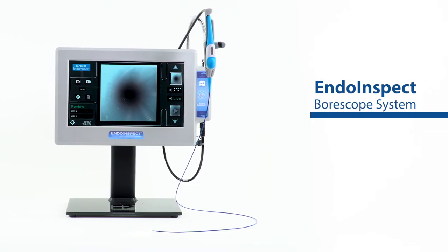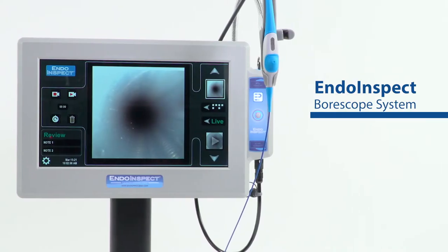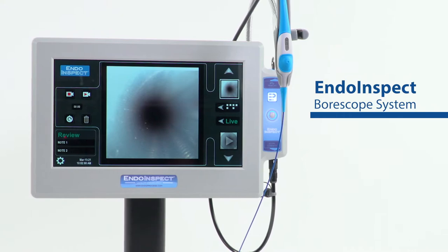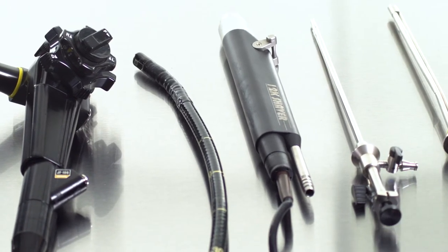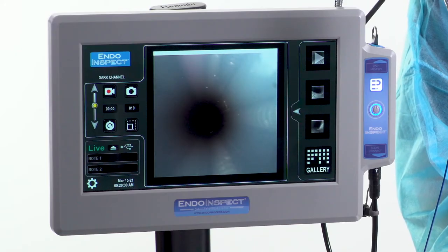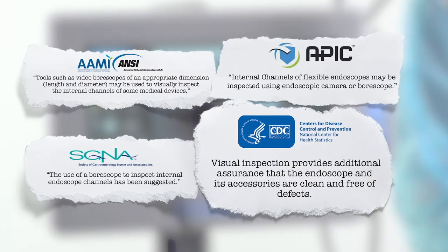AIT is proud to introduce the new EndoInspect Borescope System. Now you can visually check all your endoscopes and surgical instrument lumens for cleanliness. Hospital sterile processing departments have had no way to see inside tiny lumens and channels to verify they are free of biofilm, debris and damage. Dirty endoscopes injure and kill patients every year.